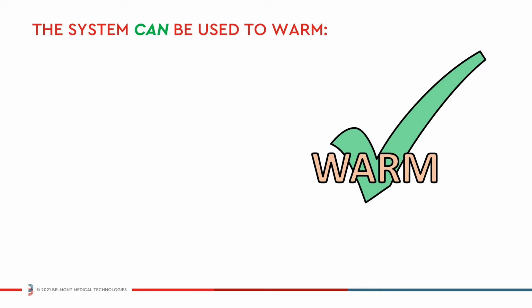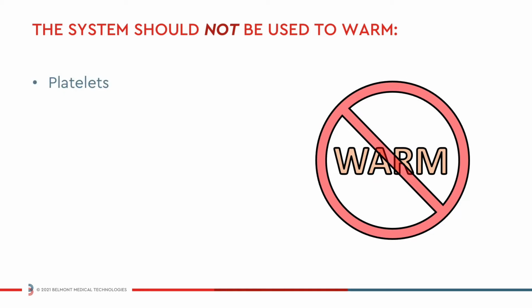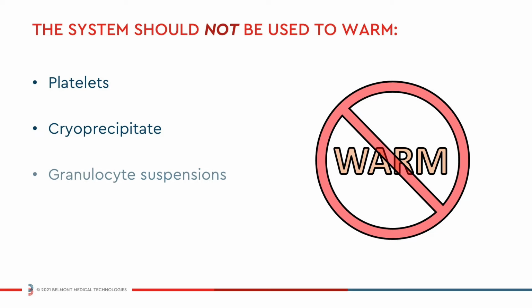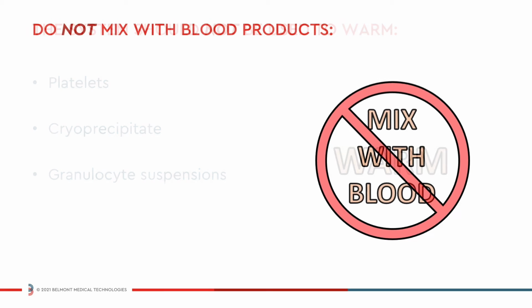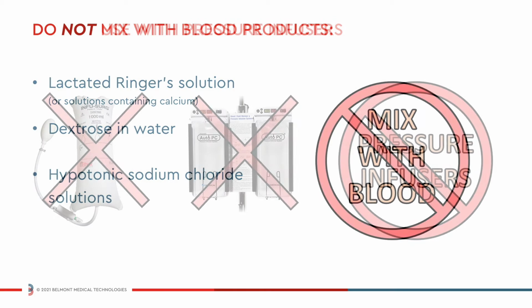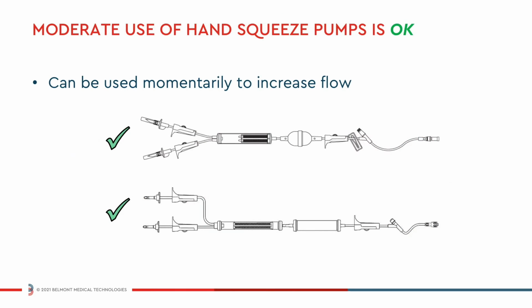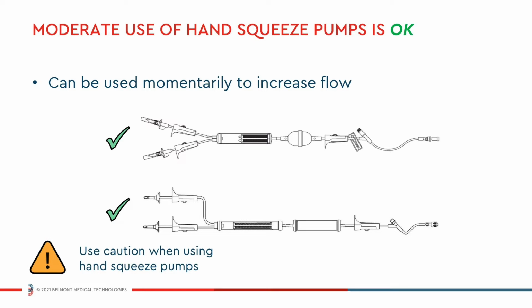The Buddy Lite can be used to warm crystalloids, colloid, and anticoagulated blood products, including packed red blood cells and fresh frozen plasma. The system should not be used to warm platelets, cryoprecipitate, or granulocyte suspensions. Do not mix lactated Ringer solution, dextrose in water, or hypotonic sodium chloride solutions with blood products. The system should not be used with pressure infusers. Moderate use of hand squeeze pumps, such as those supplied with some blood sets, may be used momentarily to increase flow, but caution should be used when doing so.